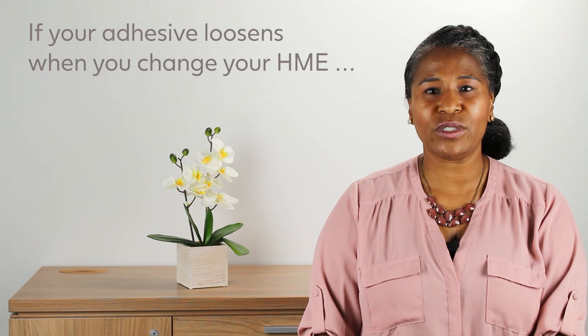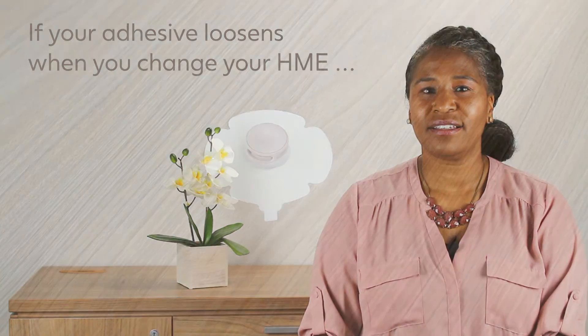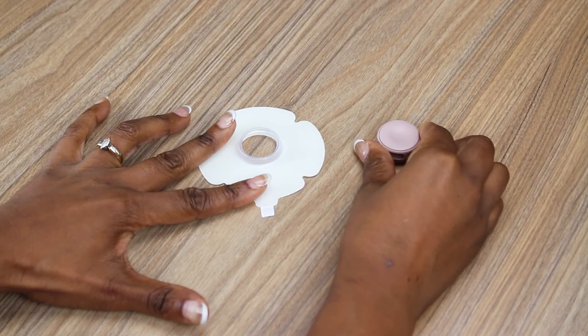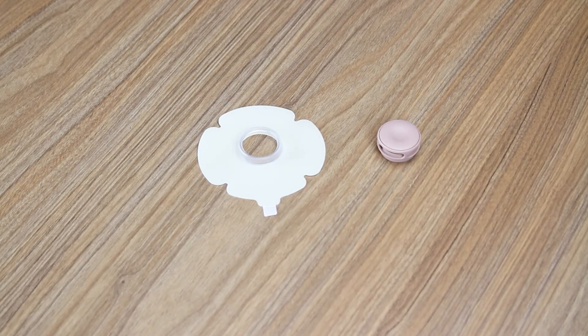If your adhesive loosens when you change your HME, hold the adhesive in place with two fingers when removing the HME. Lift the edge of the HME and remove as if you are opening a door.